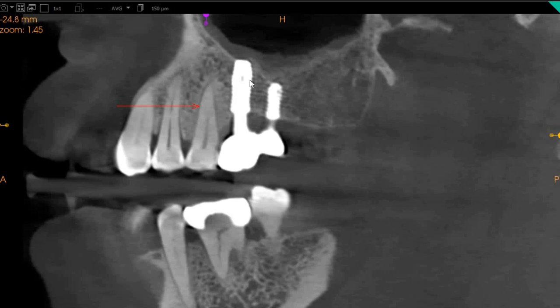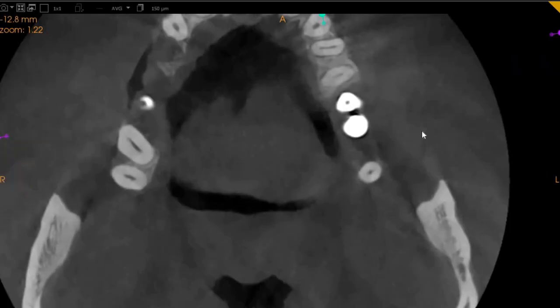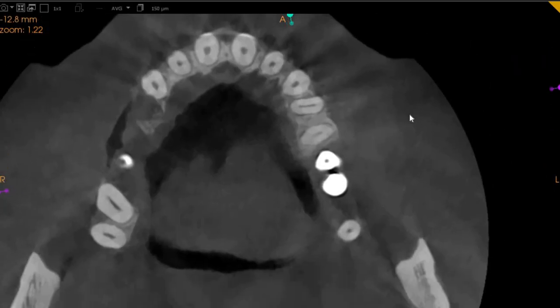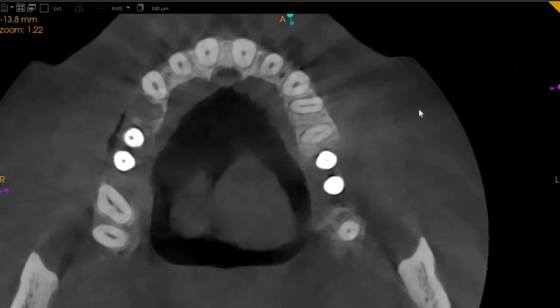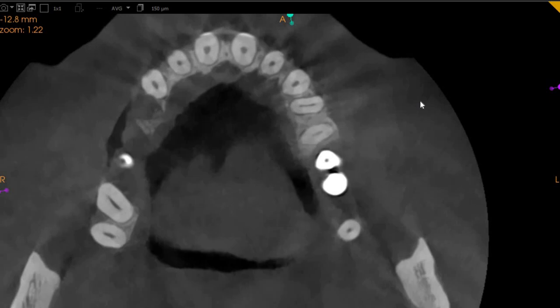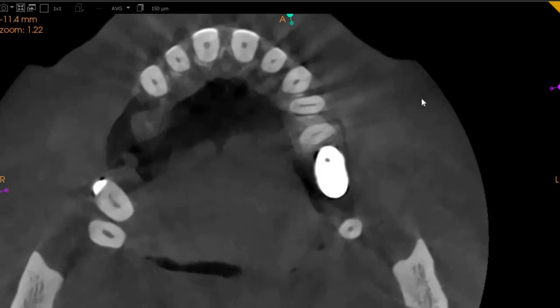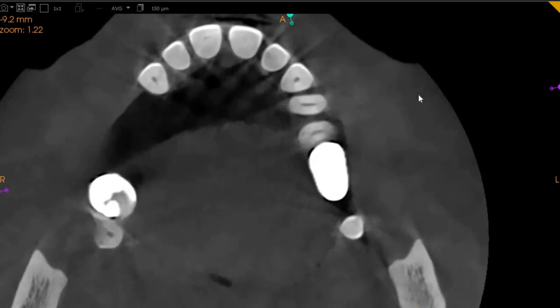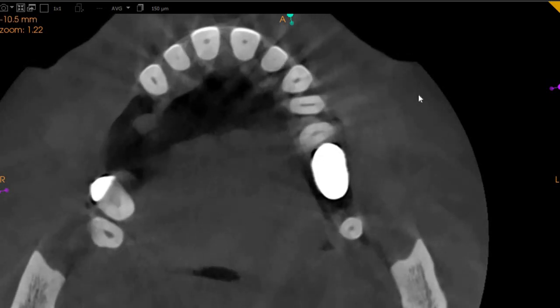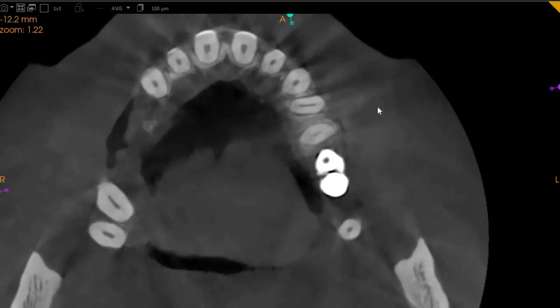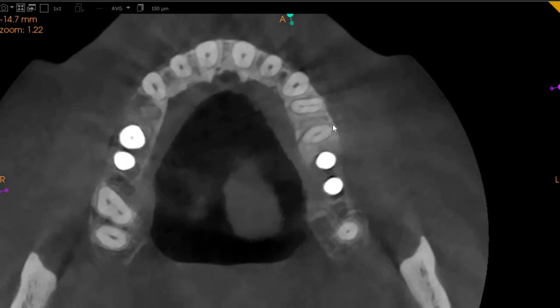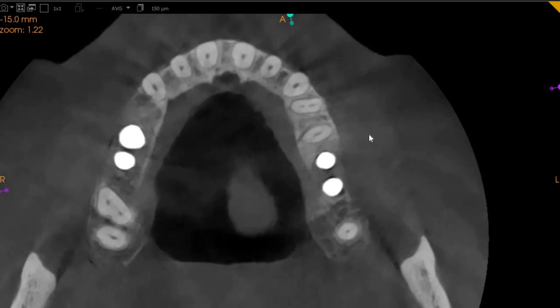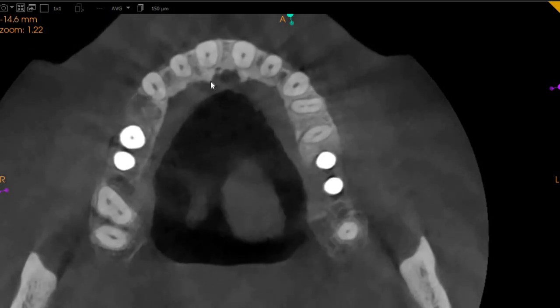We see a faint line going right here, which is also associated with a radiolucency here. So this could be a possible tooth which has a fracture present in it. Moving to the axial view, which is basically the top-to-bottom view — on the axial view it will be easier to visualize any vertical fractures. Here the upper left four seems absolutely fine.